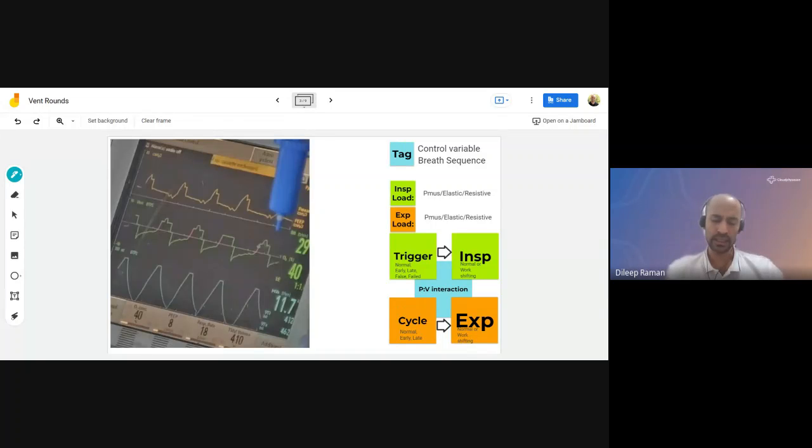That's a really interesting question. I don't know if you remember the slide from before. Let me go to that slide. The reason for that setting is actually this slide. Let me know when you can see it.